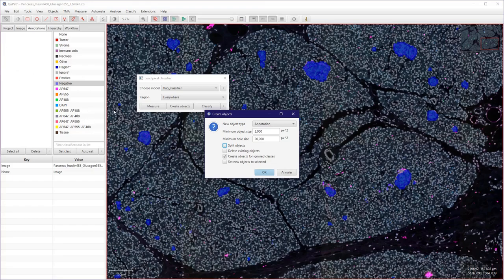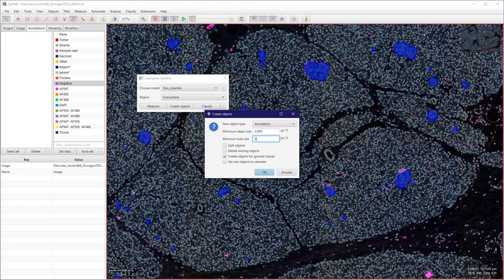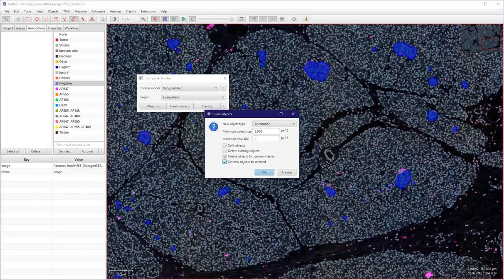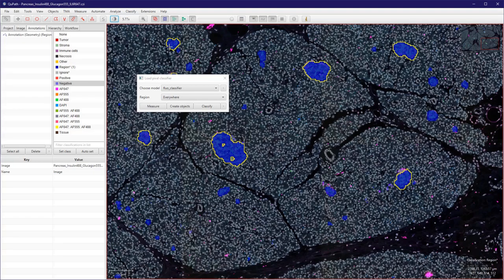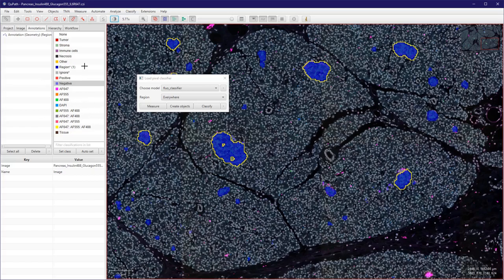So obviously here this is way too high. Let me put it to zero for the moment. And what we want to make sure is that the new objects are selected here. So create objects for the inner class, etc. OK, press OK and now we have a new annotation here and it's already selected. You can close this window here.